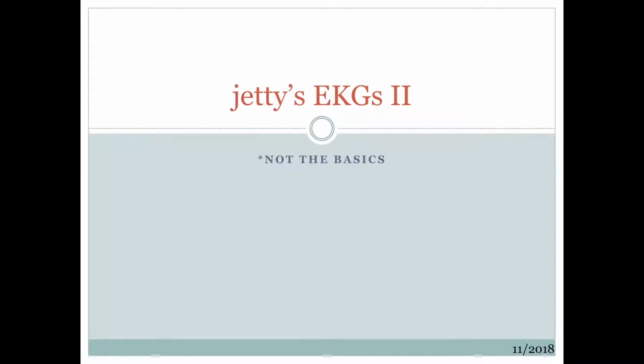Hey guys, I put together some slides going over EKG findings and the differential diagnosis for each of these findings. I did one of my away rotations up in Cleveland, and during that rotation, one of the attendings there, who was actually retired, gave up 3 days out of the week for about an hour every day to just go through various EKG findings with the medical students as well as the residents.